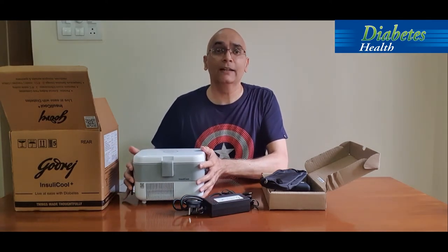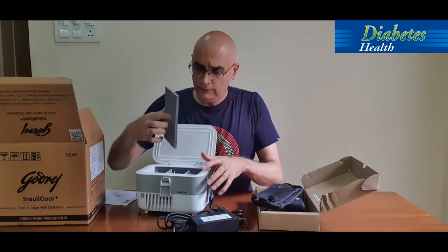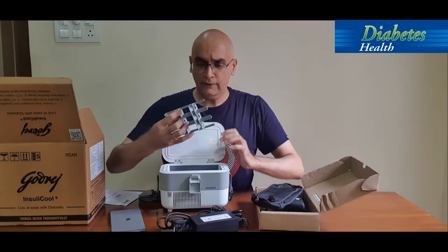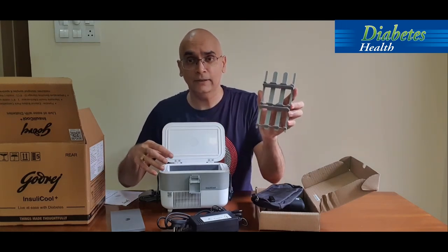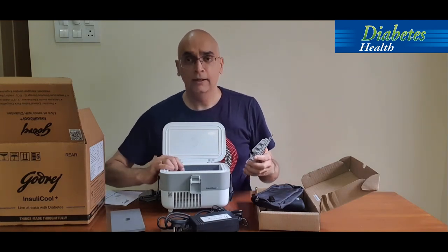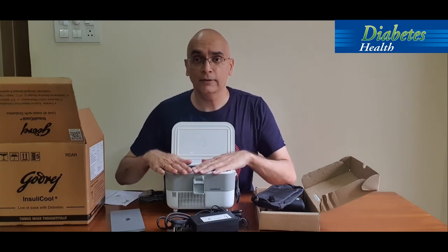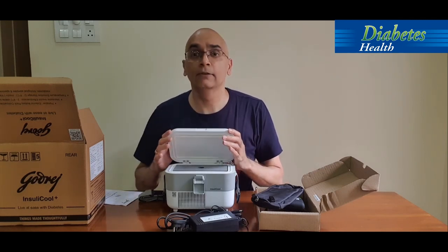When we open the unit, there is space inside for storing your vials. There's a protective cover and a nice separator if you want to store vials — all your insulin vials can be safely placed here. If you're using cartridges like me, you can just directly store your cartridges without the separator. There should be ample space to store enough cartridges for your journey.